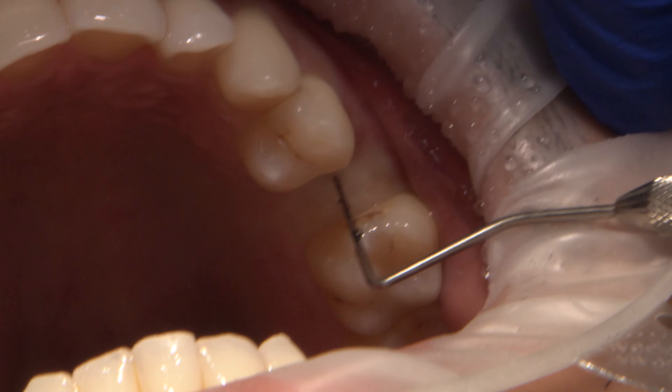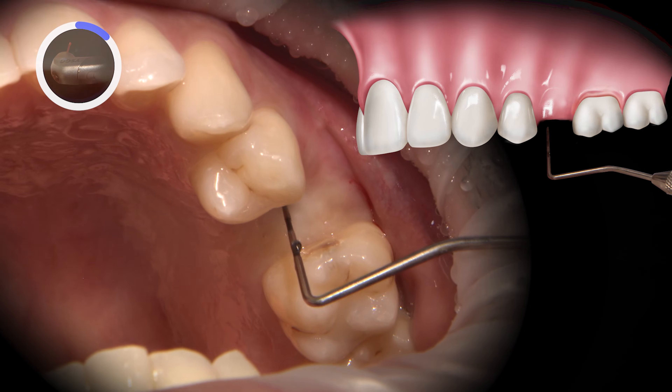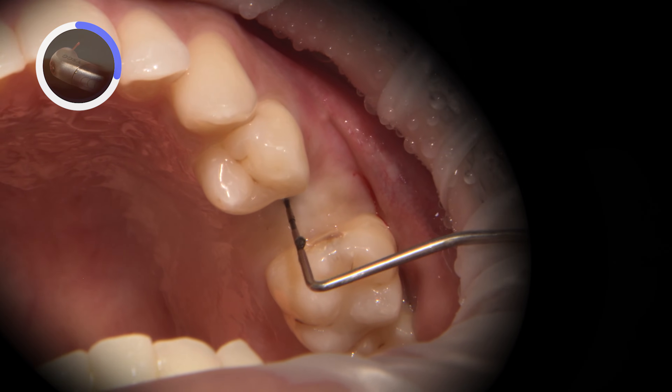After the patient is properly anesthetized, I use a perioprobe to bone sound, identifying the location of the implant platform and cover screw. I try to identify the edge of the platform as a starting point for the uncovering process.